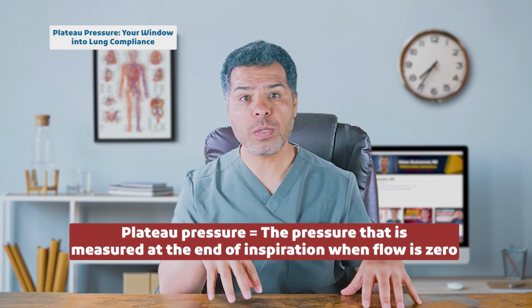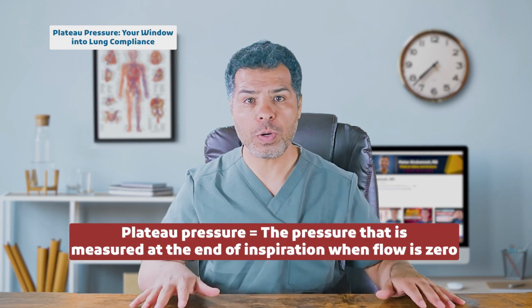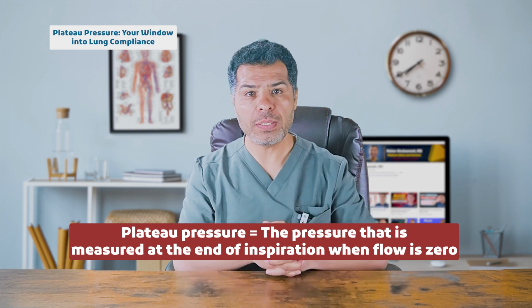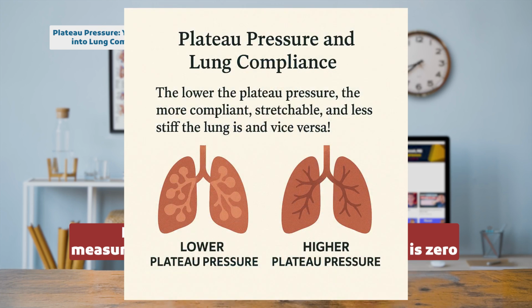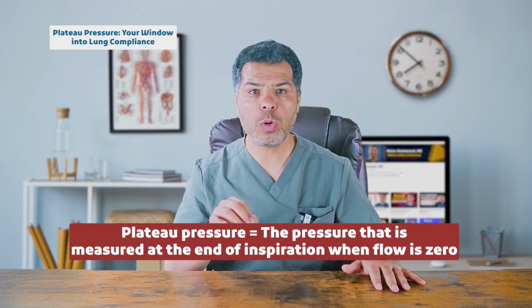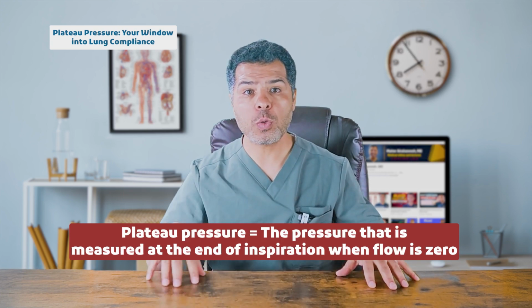In mechanical ventilation, the pressure that is measured at the end of inspiration when the flow is zero is known as the plateau pressure. Plateau pressure provides a great insight into the lung compliance. The lower the plateau pressure is, the more compliant the lung is, the more compliant and stretchable, and less stiff the lung is, and vice versa, of course. So how do we measure the plateau pressure? Simply, we perform what we call the inspiratory pause or hold maneuver.